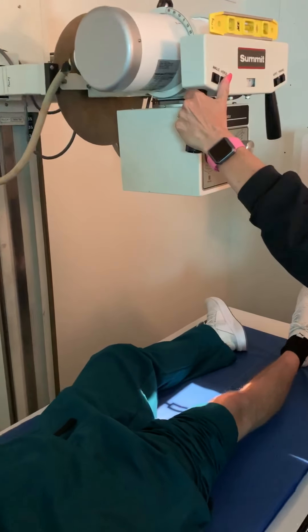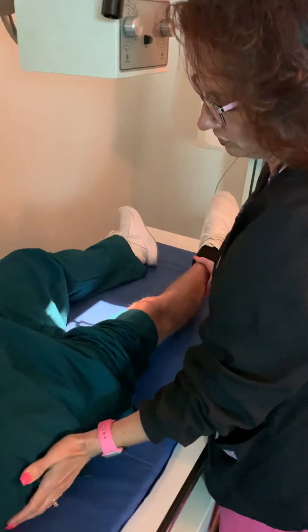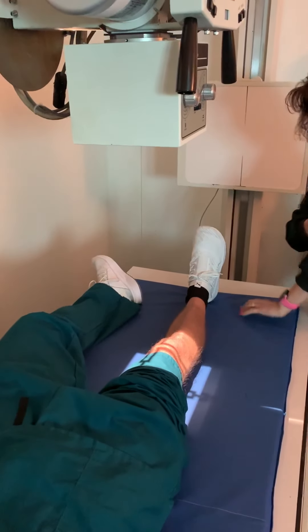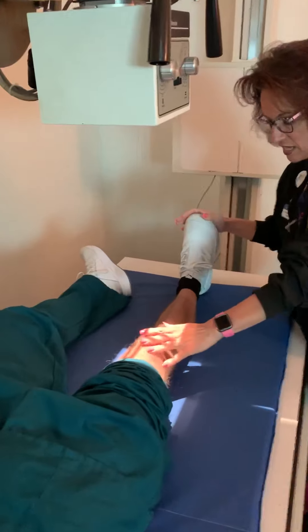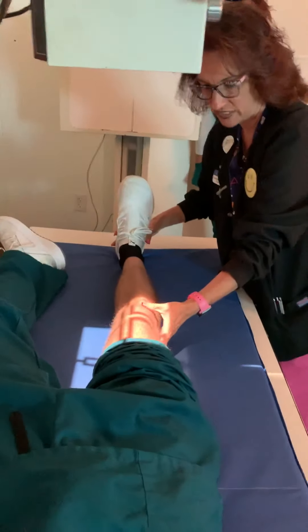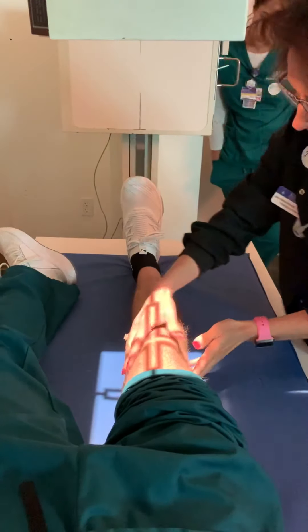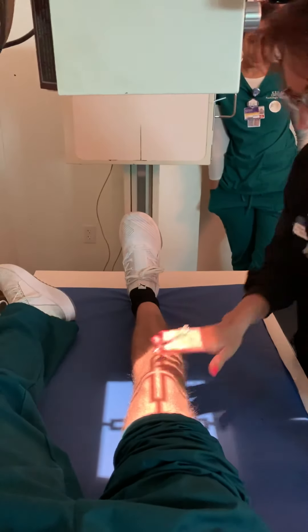So I'm going to angle caudal, which means towards the feet. Since we're in the bucky, I'll go ahead and line this up. Ideally in the field I'd have their shoe off because it's going to interfere with the mat, but for these purposes it's okay. It says most people when they lay comfortably, their leg is not usually straight. In order to get a true AP, you want to internally rotate the foot or the whole leg 3 to 5 degrees medial, looking to get the top of the knee completely AP — ankle AP, everything in line.